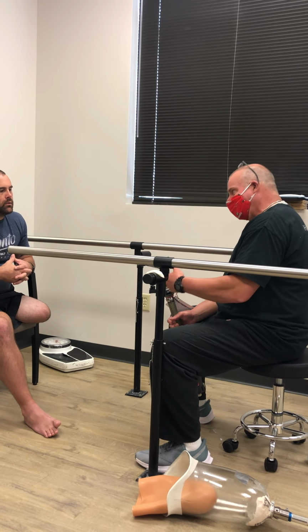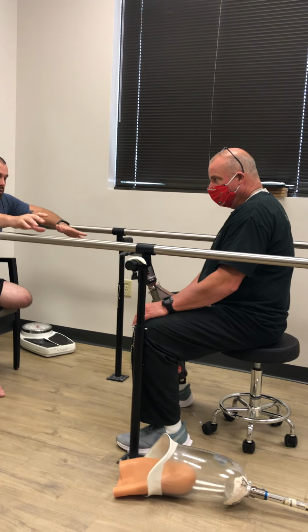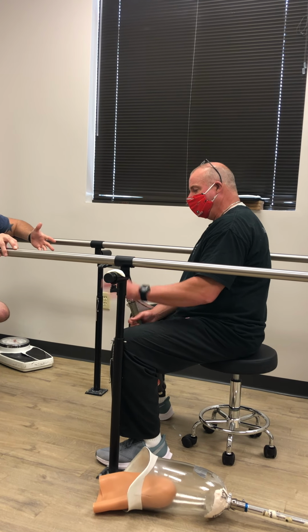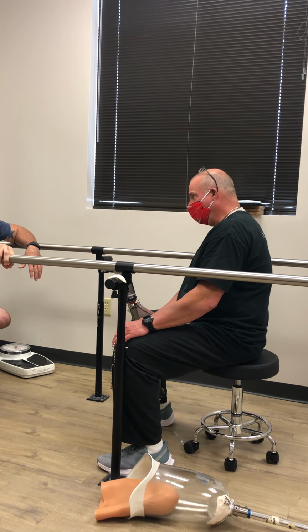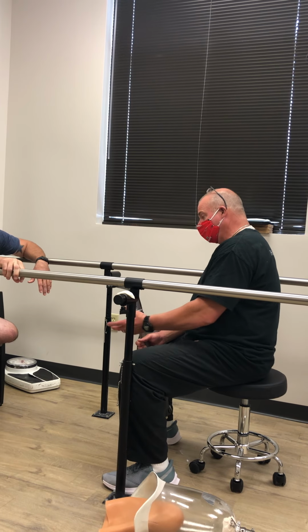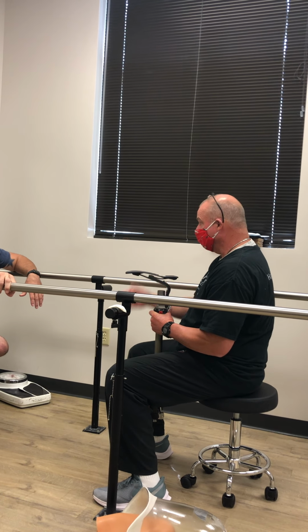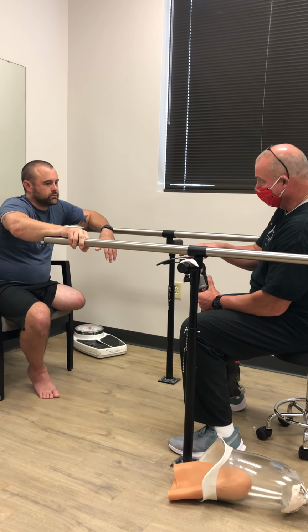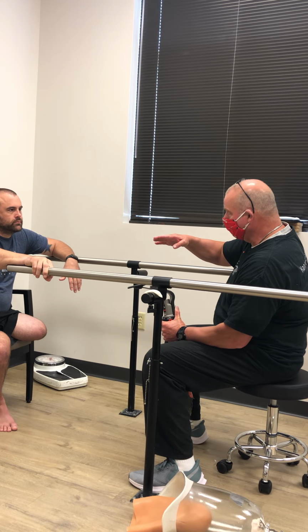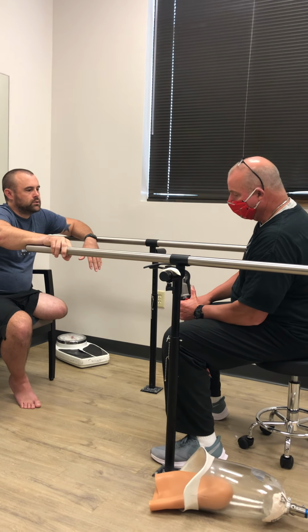So, yes, I know it's not what you wanted to hear. Before it cuts all the way through, will I notice a difference in my foot? Now you just look at the bottom. I'm assuming you'll change your socks pretty regularly, depending on the type of work you do. If you're in dusty situations and all that, you'll probably treat it very much like your sound side. So you flip that thing around and take your shoe off, take your sock off, and you're going to be staring at the bottom anyway. When it's happening, you'll see it start to wear through. Just push where it's soft, and it's going to start working its way through. This will happen even if you wear shoes. You'll probably need a new foot shell every year.